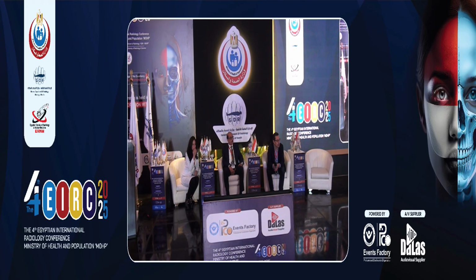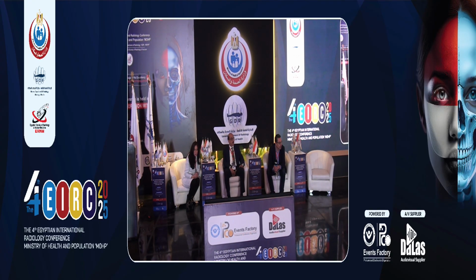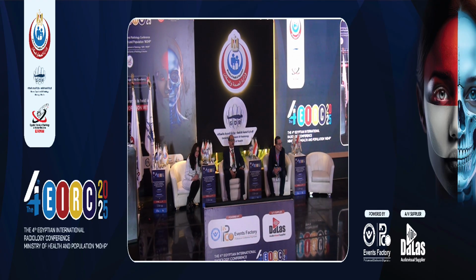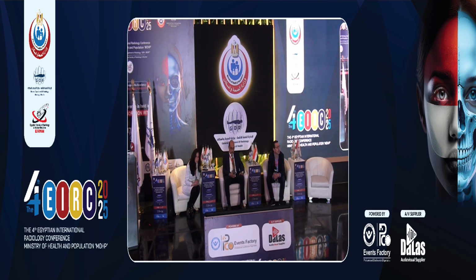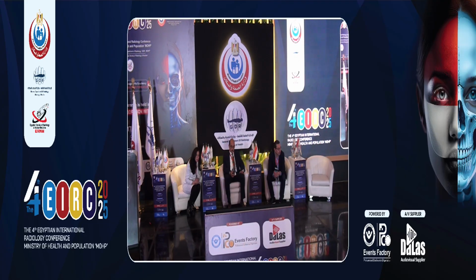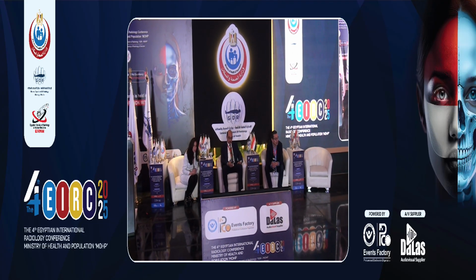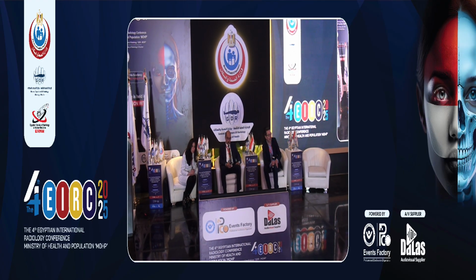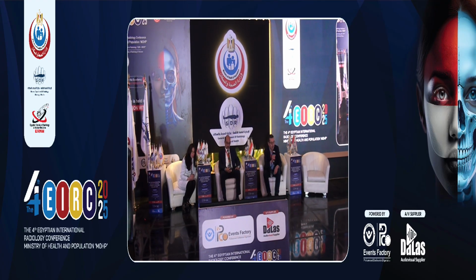Regarding our cases, these cases had already failed passage of the endoscope first, or the patient is unfit for anesthesia or sedation. All these cases are done without anesthesia, with just topical anesthesia. So it is not an alternative to endoscopy, but an additional option in cases where the endoscope failed to pass or the patient is unfit for sedation or anesthesia.